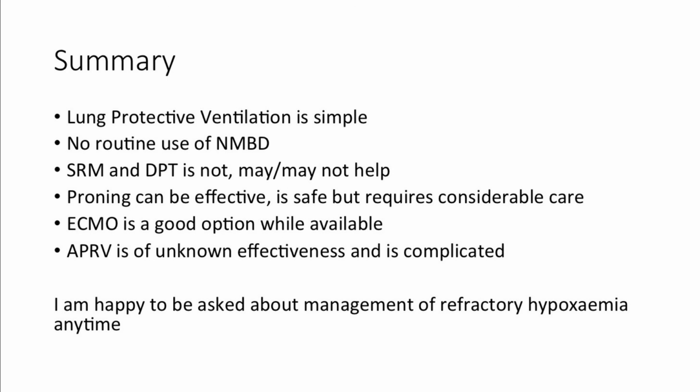APRV is of unknown effectiveness, and it's very complicated. It's not straightforward to troubleshoot. I'm going to be around as much as I need to be to help people with refractory hypoxemia, and that's it. Any questions?